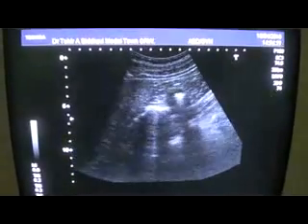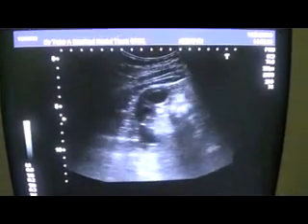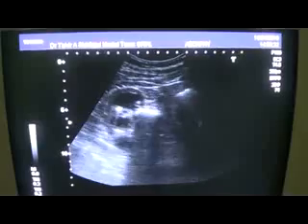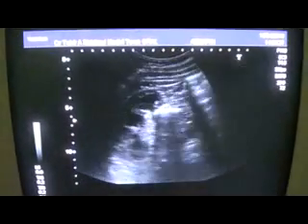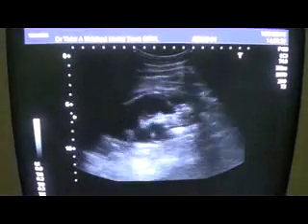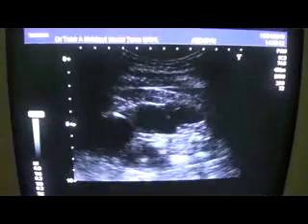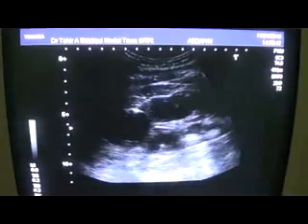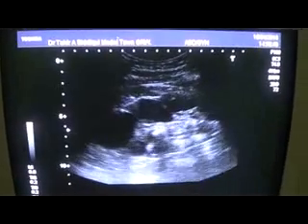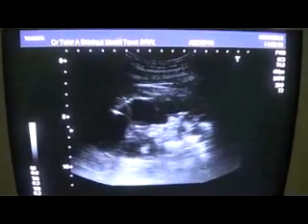Now remember that if you concentrate and then give a sweep to the probe of approximately 90 degrees and then bring it, magnify a bit, and then you will see that these all converge to the central sinus complex or the collecting system.